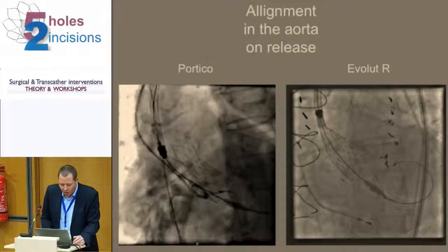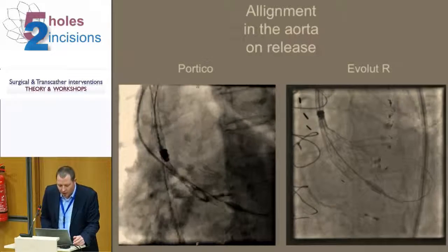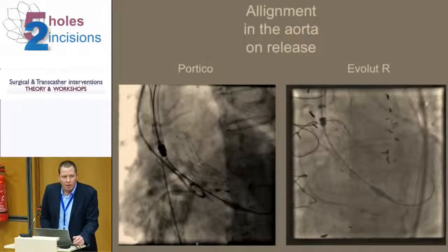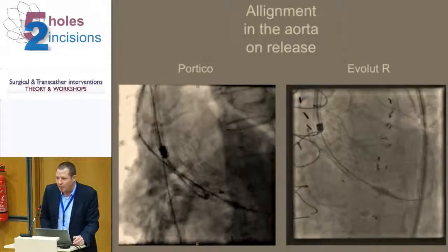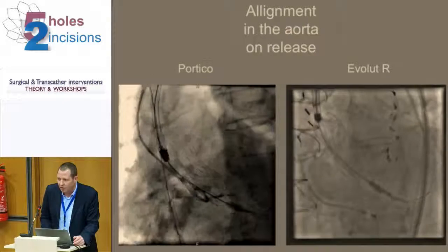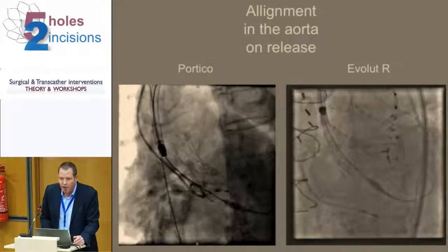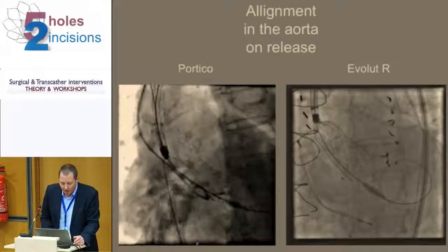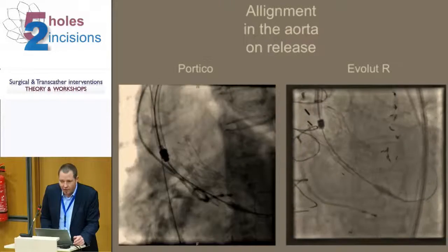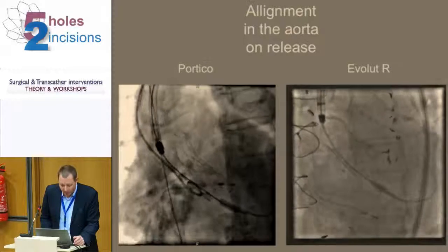But still, it's a good thing, and I think this has improved the results, especially for the CoreValve, tremendously, because people are now a little bit more brave to aim a little bit higher. If you get ejected, it's not a bad thing; you can resheath and go for a second attempt. Whereas with the old version, you need to drag the whole thing through the arch and then into the caps, into the sheath again, and this is why most CoreValves ended borderline low, which then created leak and pacemaker.